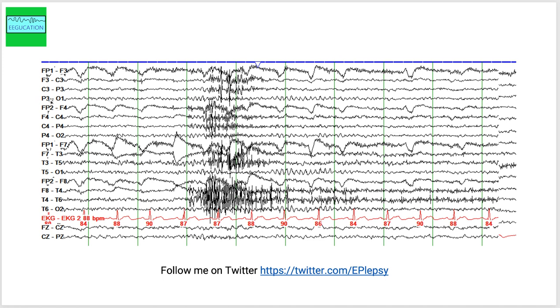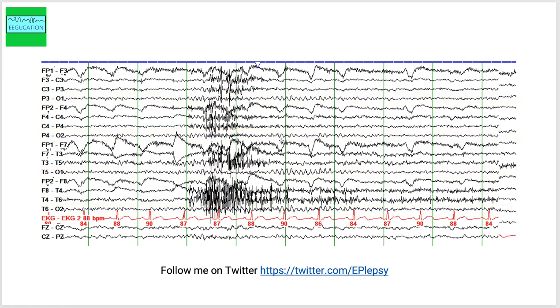What we see here, something to note here, that in the occipital head region, so P3-O1 and P4-O2, if you look over here you can see the posterior dominant alpha rhythm here. So this is the alpha rhythm. This is in the left side. You do have some alpha rhythm on the right side right here.